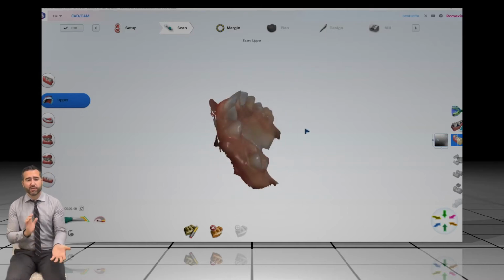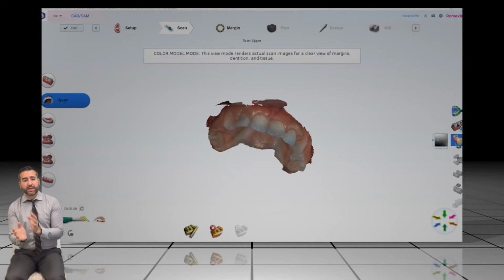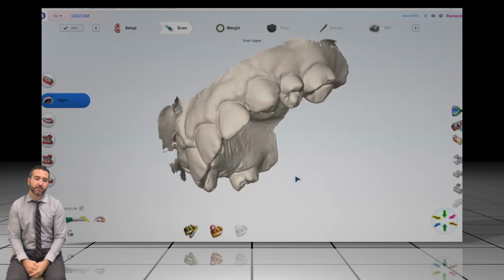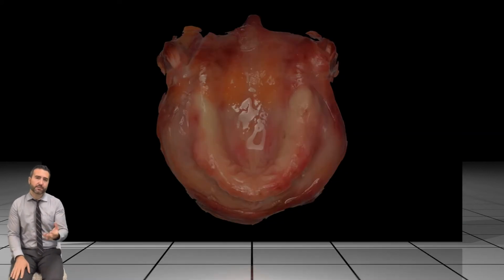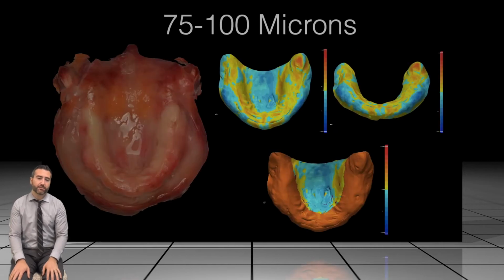So, you know, we're doing these studies and we're showing how accurate these things are, but we oftentimes forget the patient experience and how excited they are to see their mouth on the screen like this. And I always have front-facing monitors hooked up to my chairs so that they're able to experience and see all this. And it's not just for me, it's actually more for them. And so back to the soft tissues, this was another pretty amazing study where they took a cadaver maxillary arch and they scanned it with all the various different scanners on the market, and they found incredible accuracy for these scanners, guys.